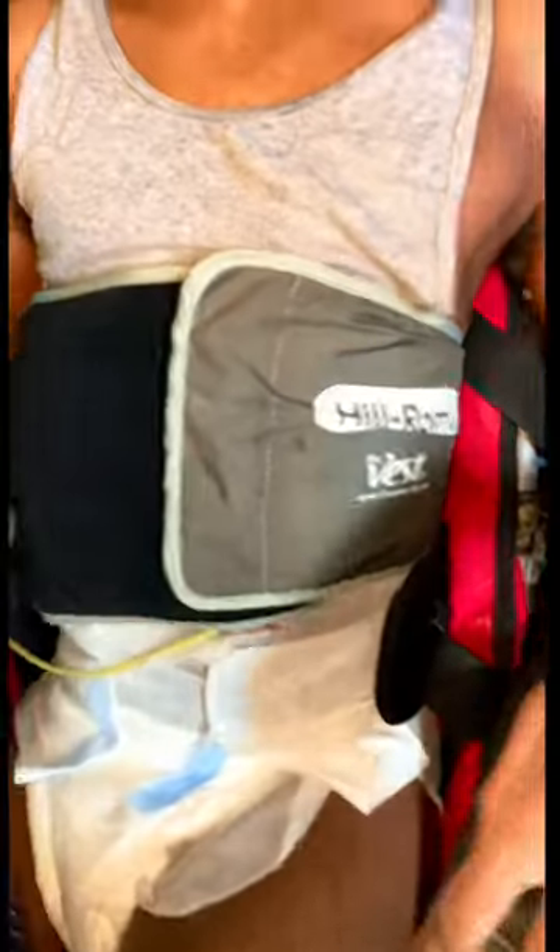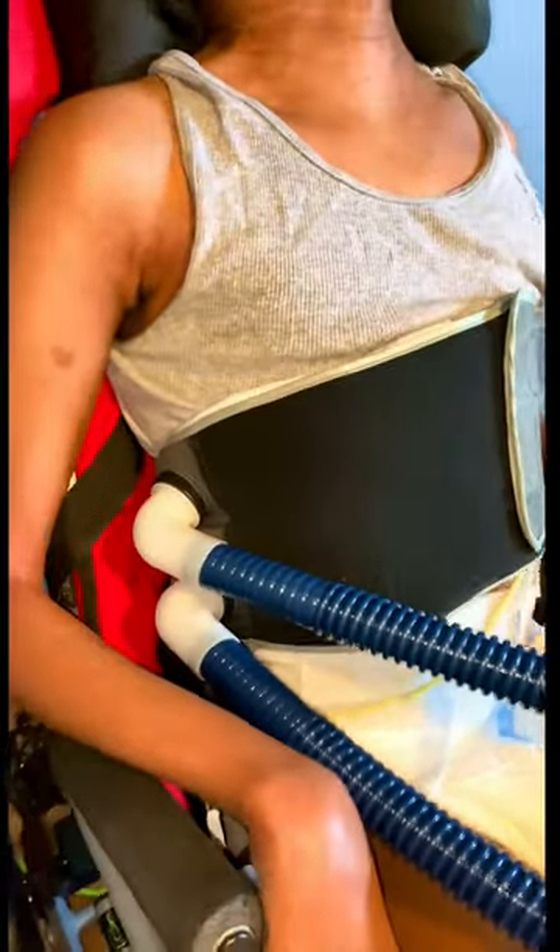We let the Shake Vest go for 10 minutes. As you see, it's literally shaking his lungs, shaking his torso area, so all that mucus can be loosened up so he can enjoy his day — he can laugh, he can smile, he can have fun. That's what it's all about.